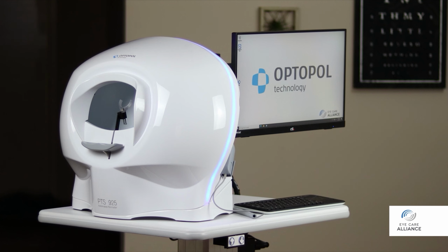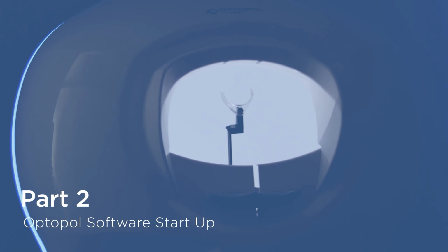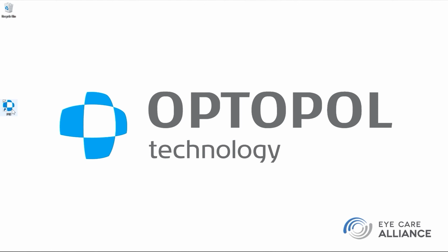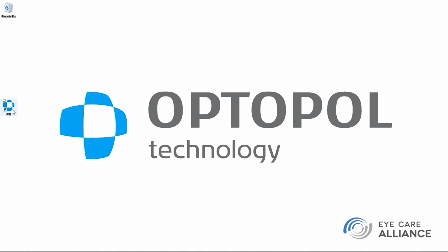As with most automated perimeters, ensure the room lights are as dim as possible, with no light shining directly into the bowl. After logging into Windows, the PTS software is found on the desktop. Before opening, verify that the instrument displays a single red dot in the bowl, which confirms that it has fully started, without errors, and is ready to communicate with the software.